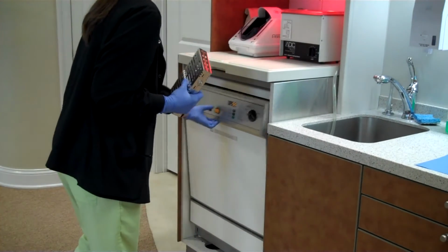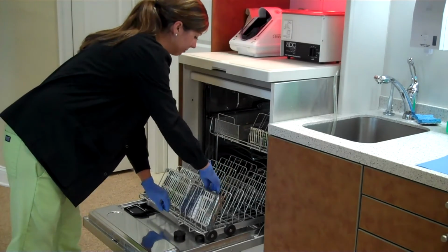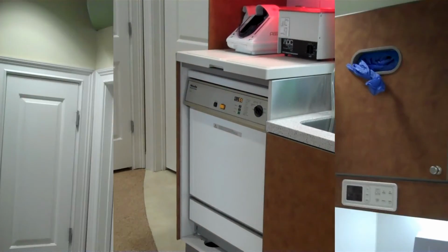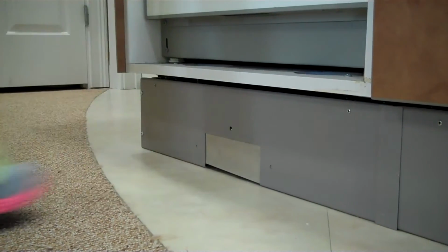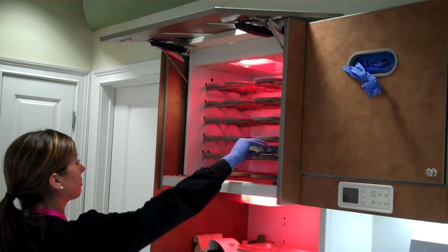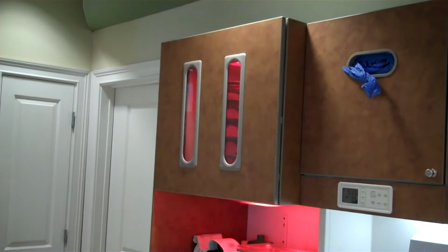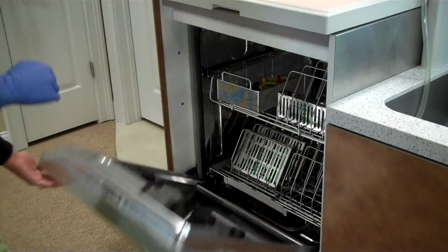Once instruments have been used, they are brought to the dirty side of the Sterilization Center and are placed inside our thermal disinfector to begin the sterilization process. If the disinfector is running, dirty instruments are stored in the dirty cabinet until they can be loaded into the disinfector. You may notice that our cabinets open and close by a pneumatic foot pad. This further reduces the potential for the spreading of germs by keeping the cabinet doors hands-free.